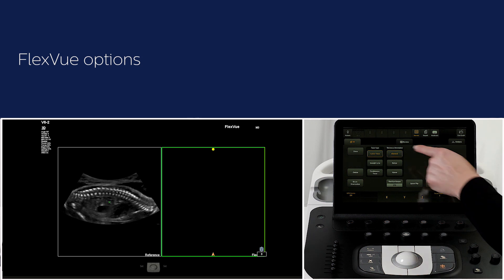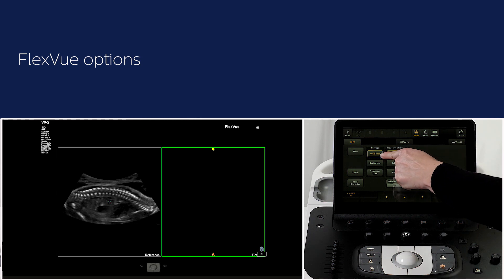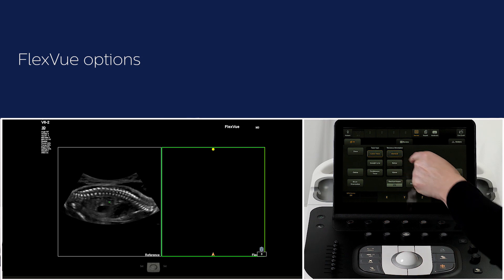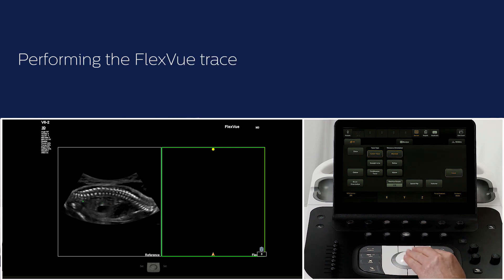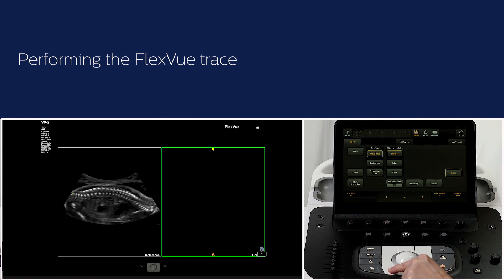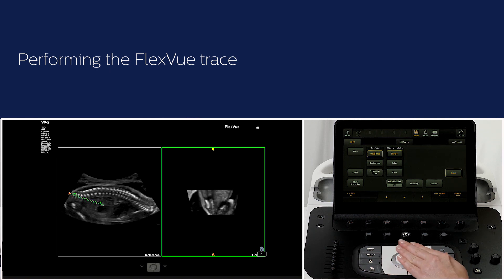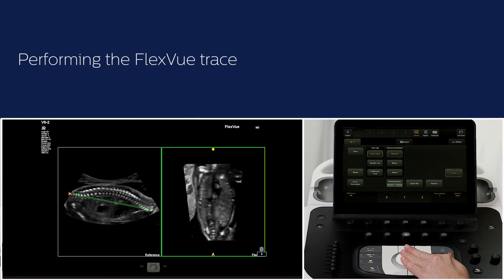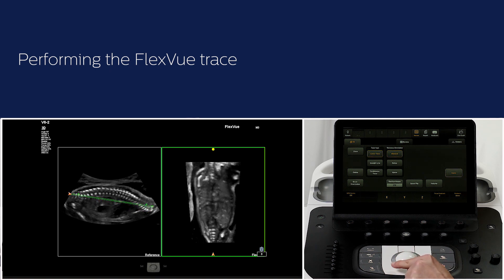We will select curve trace. Place the cursor where you want to start the trace line and press set by using either the right or left button next to the trackball. Use the trackball to draw the trace line and press the set button to place the end position of the trace.